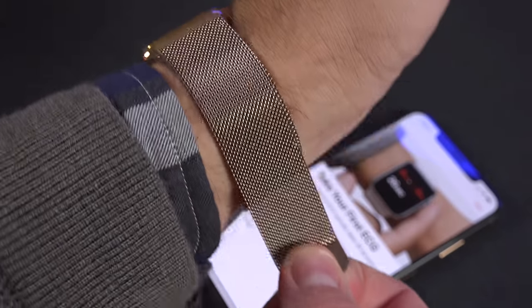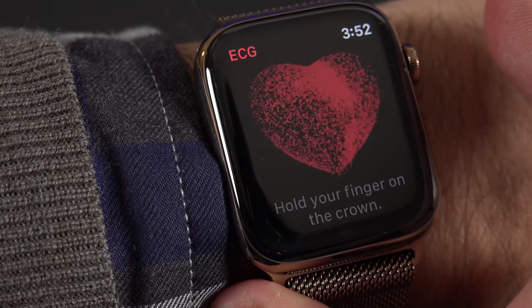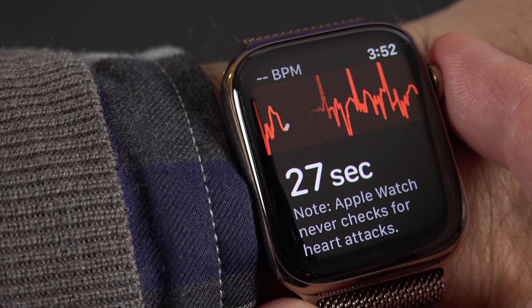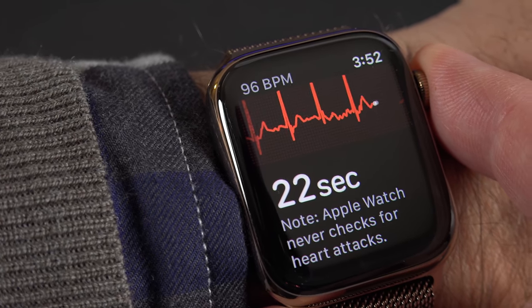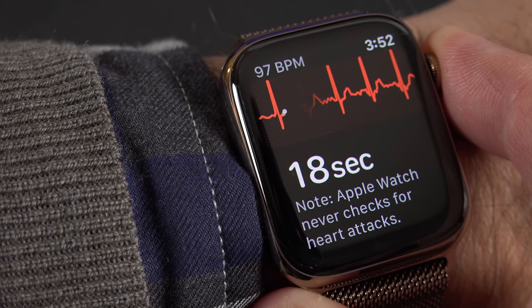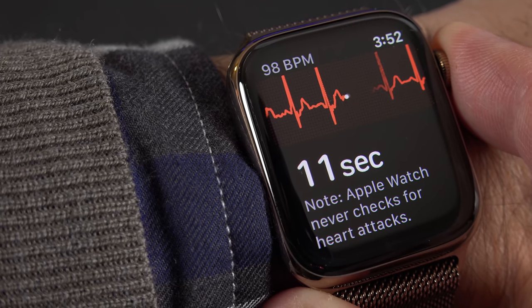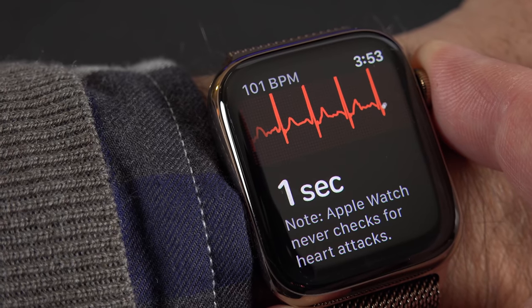To measure your EKG, just make sure your Apple Watch is nice and snug against your skin. Then all you have to do is activate the app and press your finger — the opposite finger — against the digital crown. This completes the circuit across your body so it can measure your electrical activity. You have to be sitting down with your arms laying flat on the table — you cannot be moving at all. If you don't follow these instructions precisely, you're going to get inconclusive results. It takes about 30 seconds to record your EKG, and you can see a live readout on the screen.